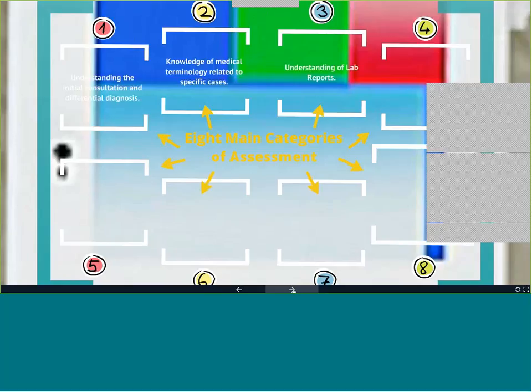We have understanding of all of the lab reports, knowledge of imaging studies related to each of the competencies, evaluation of the stage and grade of the cancer using the AJCC staging form, which is the American Joint Commission on Cancer. Sixth, we have evaluation of 2D X-ray films and 3D CT and MRI scans in determining treatment setups. And we continue to use 2D X-ray films for students' use in our simulator room.